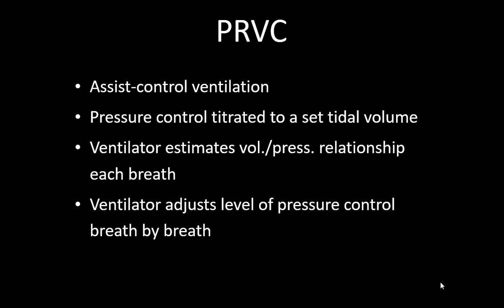PRVC is in Maquet and many other ventilators. It's pressure regulated volume control. Again, I would say this is a misnomer. Technically, they are volume-targeted pressure control breaths. Why have they given this name, pressure regulated volume control? Because the first breath is given as a volume control breath.